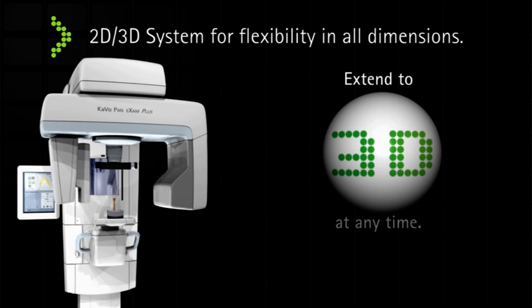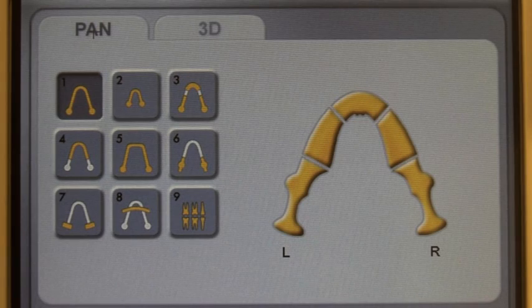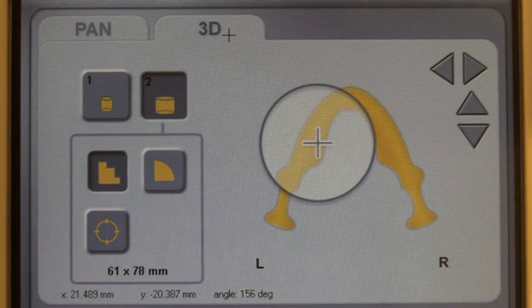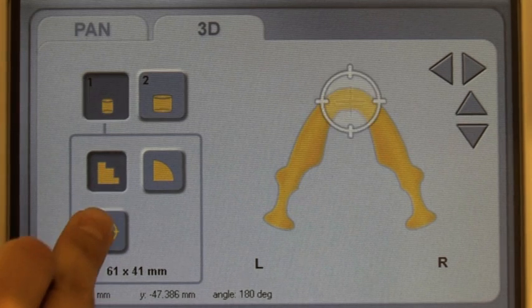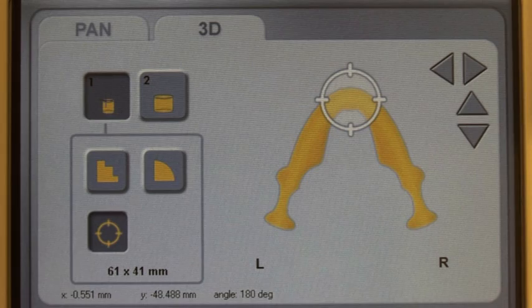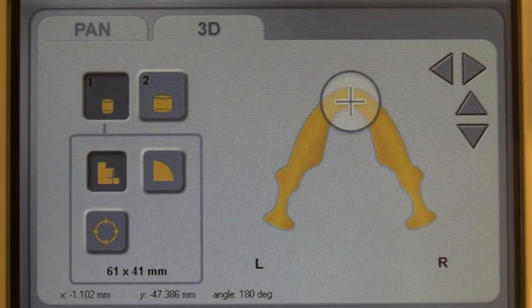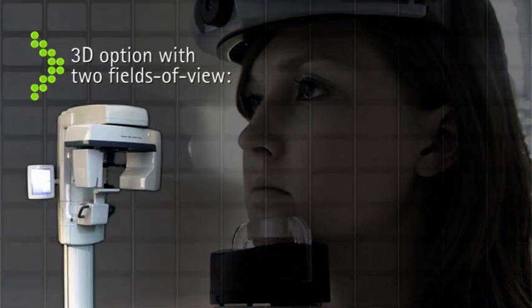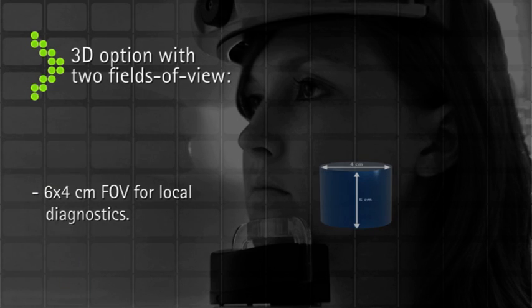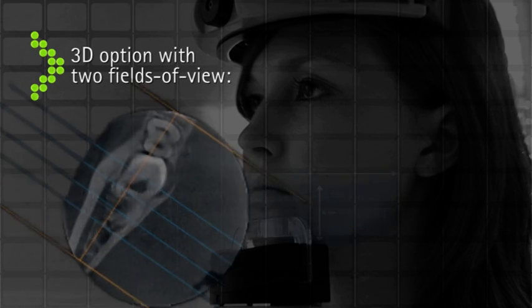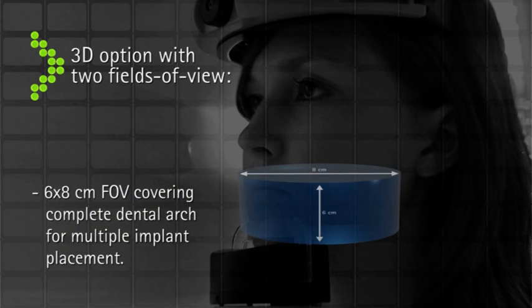The Pan Exam Plus can be switched to 3D at any time and offers an optimum selection for optimum 3D images. Different volume sizes and different resolutions offer the perfect solution for optimum 3D images. The 6x4 volume for local diagnostics and 6x8 volume to display the entire jaw arch.